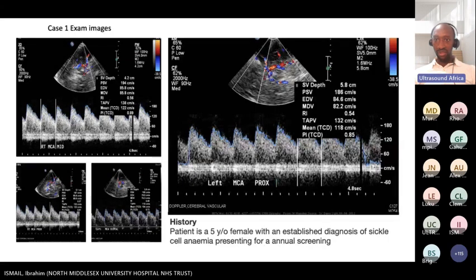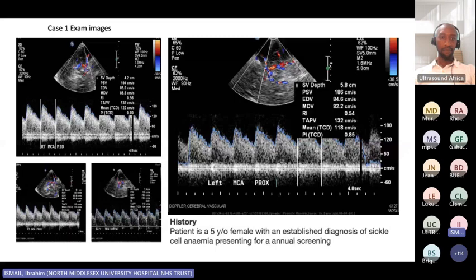For purposes of sickle cell anemia screening, which of the vessels is most important to assess? That's a question from Ms. Haku. The STOP trials always put the most emphasis on the middle cerebral artery, terminal internal carotid artery, and they recently added, I think just over 5 years ago, the anterior cerebral artery as well.